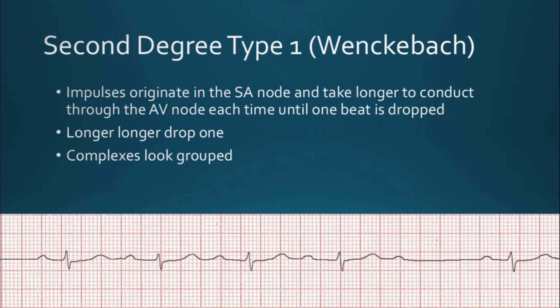Sometimes when the block is consistent, the QRS complexes are said to be group beating — you'll notice beats are grouped together, then a pause, then another group. Looking at this closely: P wave then QRS, then a prolonged PR, gets a little longer, a little longer, then a P wave with no QRS — that one was dropped. Longer, longer, longer, drop. This is your second degree type 1.